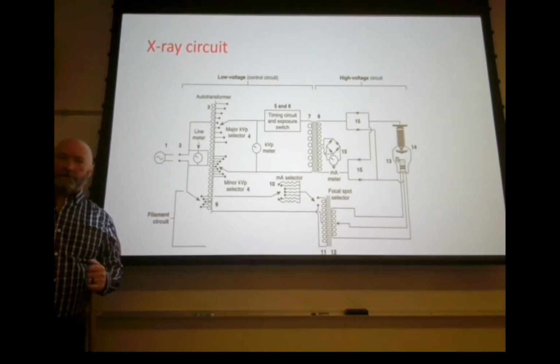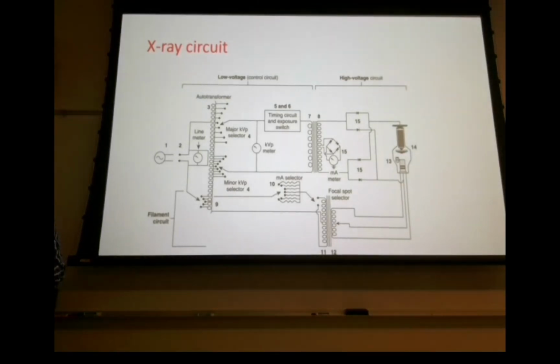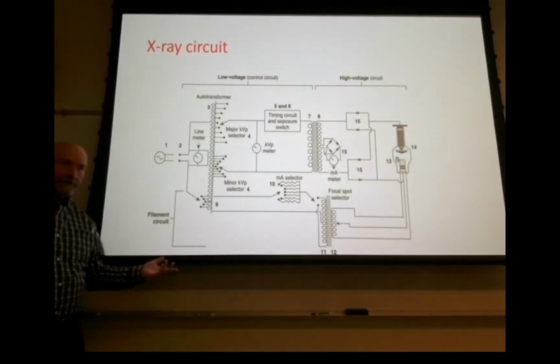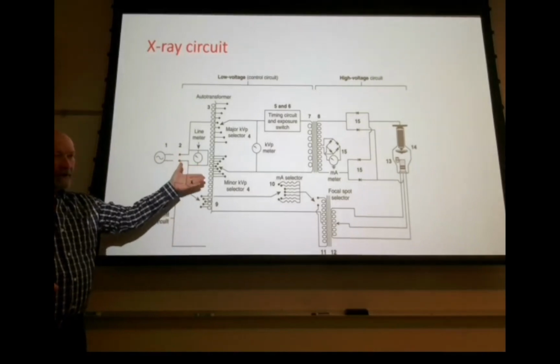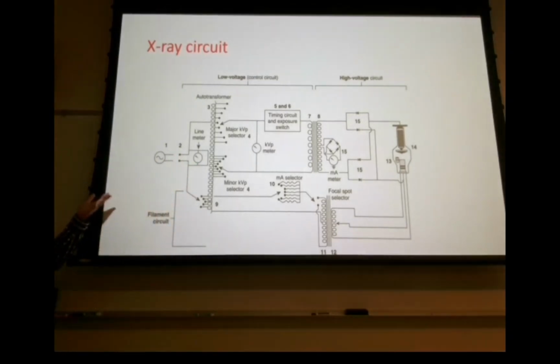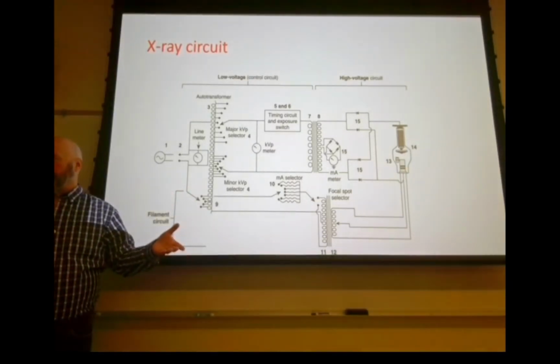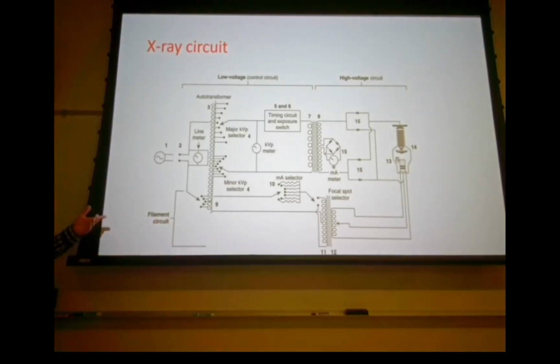One is it's a surge protector, so that at the moment that you make your X-rays, your incoming line voltage, I think according to Bushong, can fluctuate by as much as 5%. 5% can make a difference. If you make your exposure during a power surge where the power coming into your X-ray system increases by 5%, then essentially what you've done is you've increased the exposure to the patient by 30%. Okay? So you don't want that.